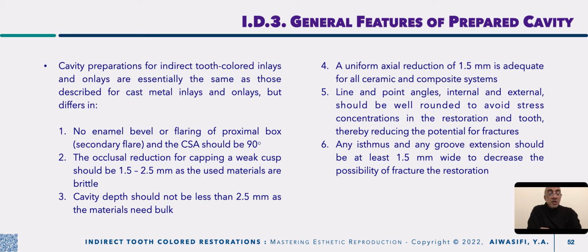That's why there is no enamel bevel or flaring, and the cavosurface margin should be finished at 90 degrees, because those materials, either composite or ceramics, cannot be finished like gold, which is ductile, into thin margins. Otherwise, it will fracture under occlusal loading force, leaving an open margin.